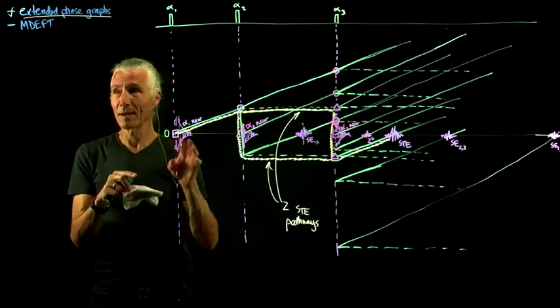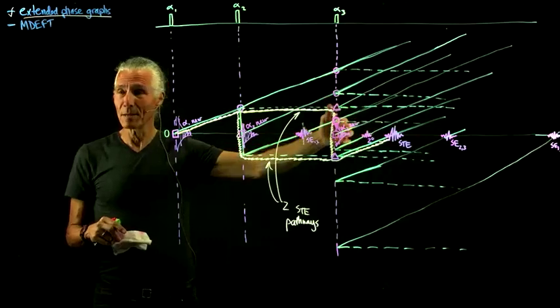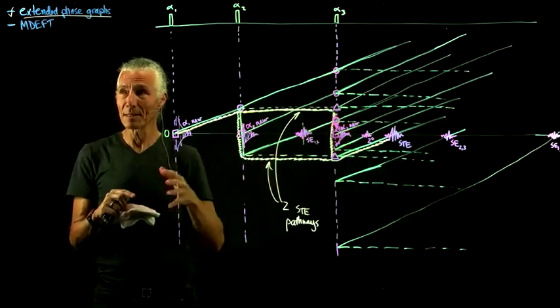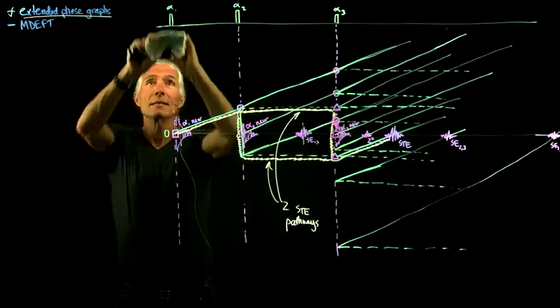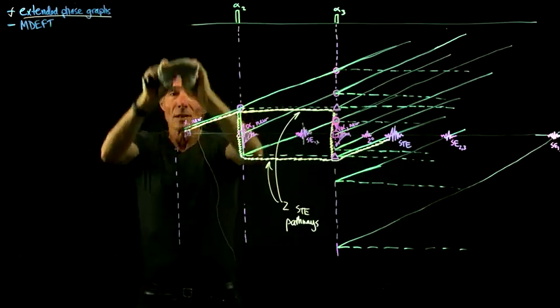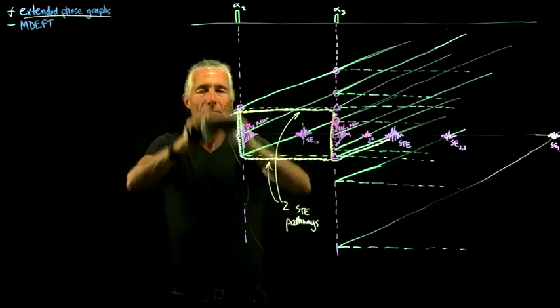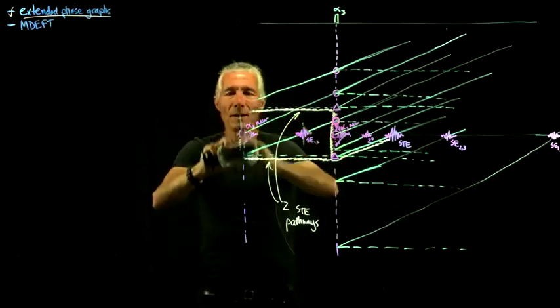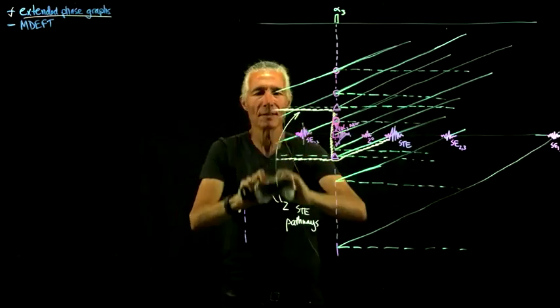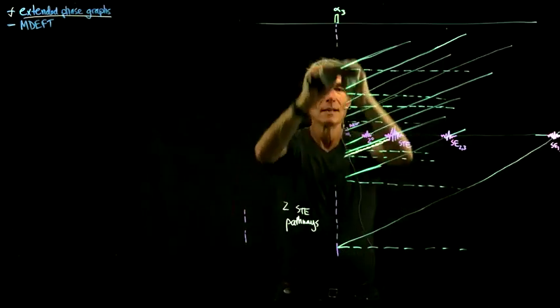And so each pulse is splitting the pathways, and you end up with millions of pathways on top of each other. Those pulse sequences are partly designed using something like this to see how we can pile the echoes on top of each other or stop the echoes from interfering with each other.